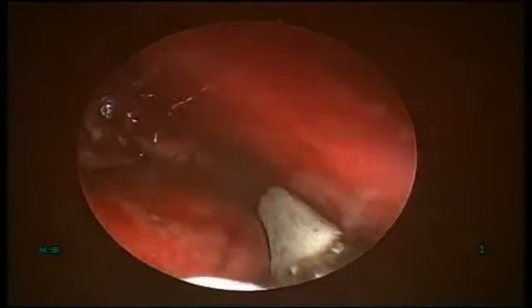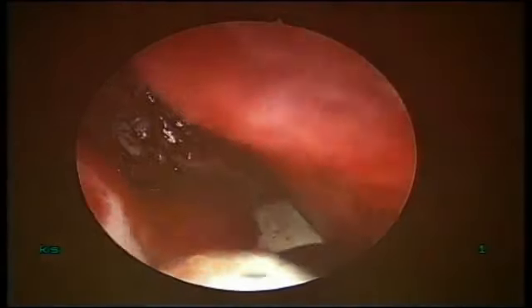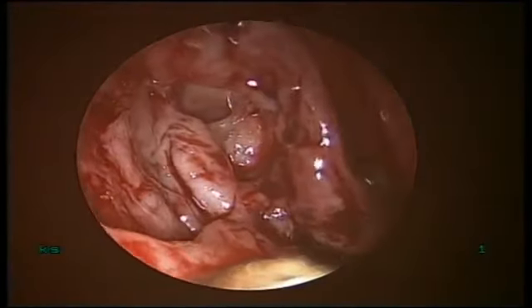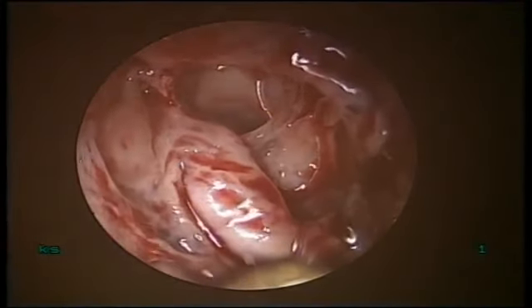Next day onwards, we start the normal saline irrigation. And right now I am using the various gel foam pieces to stabilize these flaps in their place. So you can imagine this kind of an opening in the lateral nasal wall. See that? Big opening, and that's why I want these flaps to remain in place.